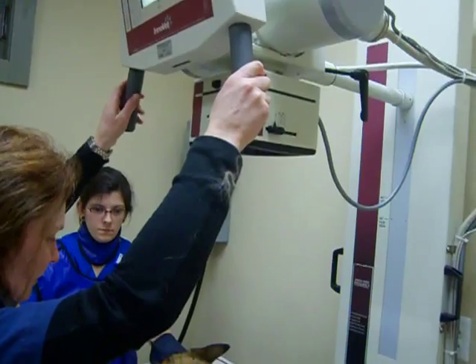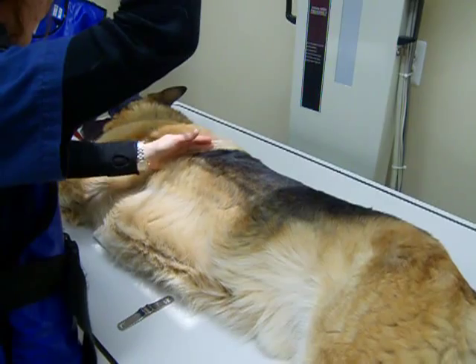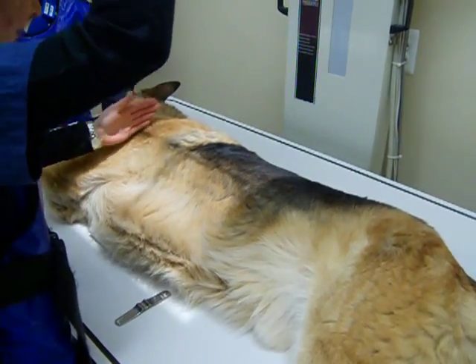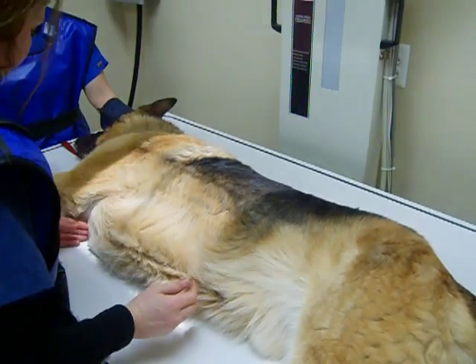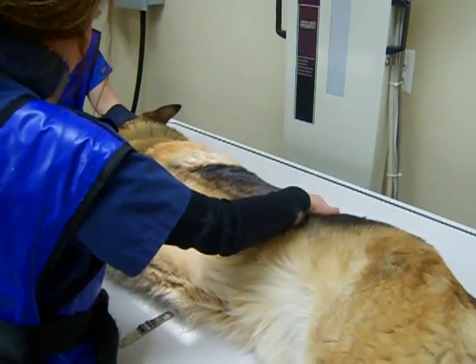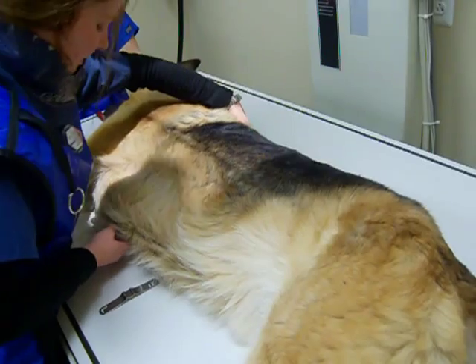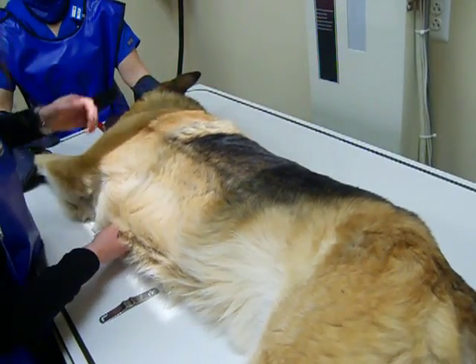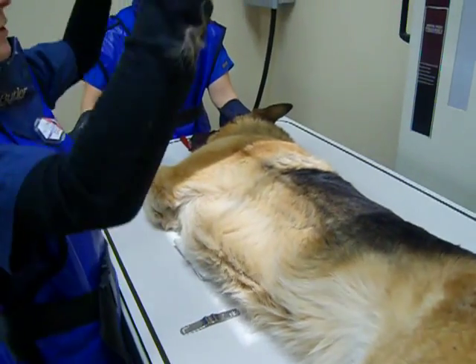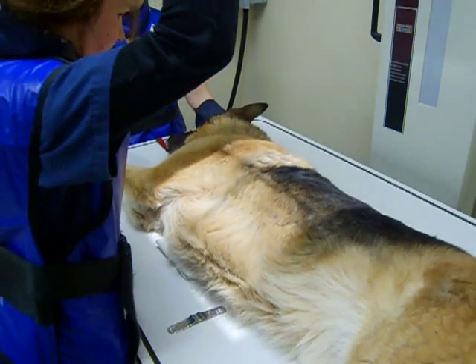With the primary beam, we'd make sure that we were centered on the scapula, and we'd collimate from the manubrium to the first lumbar vertebrae, making sure that we include the sternum and the spine. We would take our projection on peak inspiration.